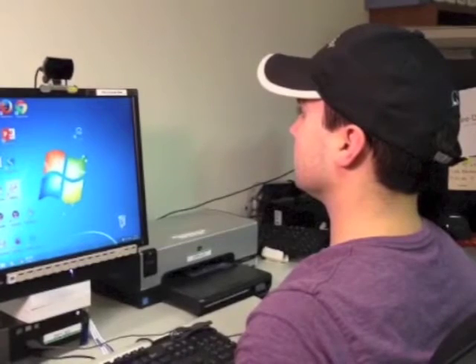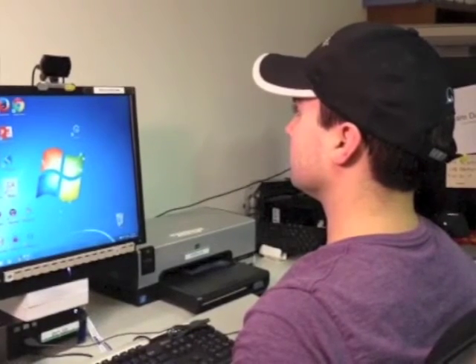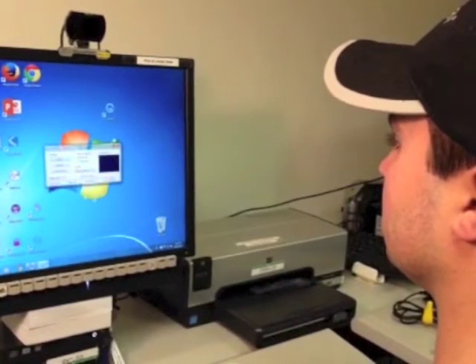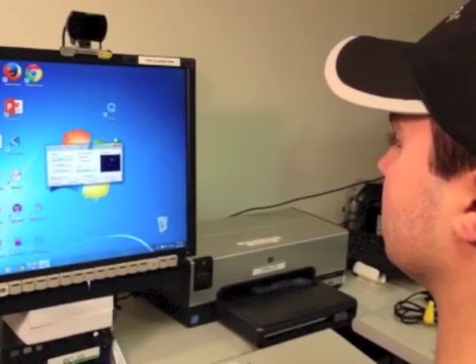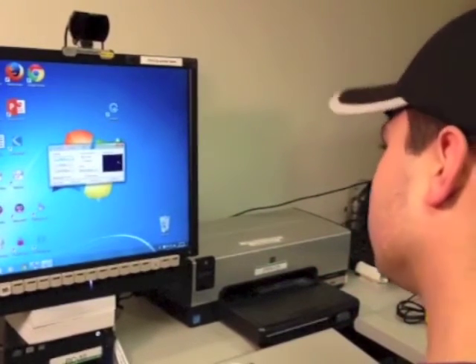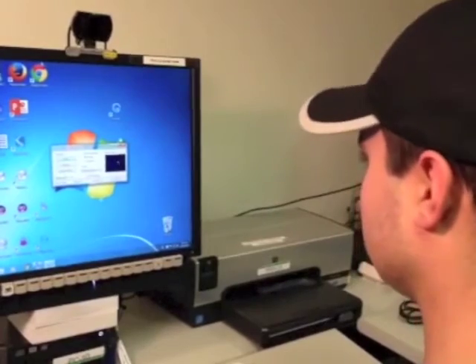The further back you are from the monitor, the more head movement you will need to control the cursor. To calibrate the software, open the SmartNav program. Move your head all the way to the left, to the right, up, and down. You will see the cursor moving within the camera view window.